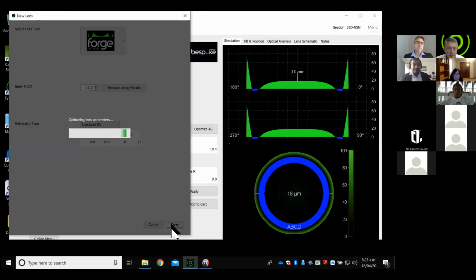And we do have a number of practitioners who use this system of reference mapping using topographers that are not capable of importing into iSpace, and they still generate Ortho-K lenses from that, which they then fit. Keep in mind, you do lose a bit of the detail from using an actual map versus the reference mapping.